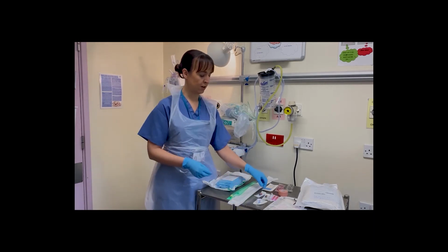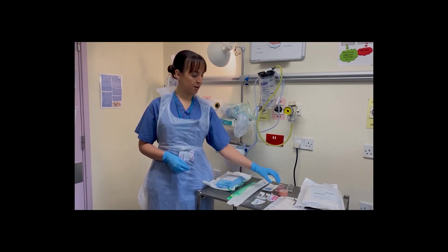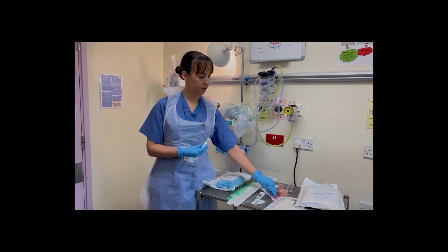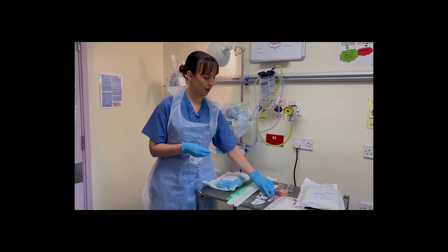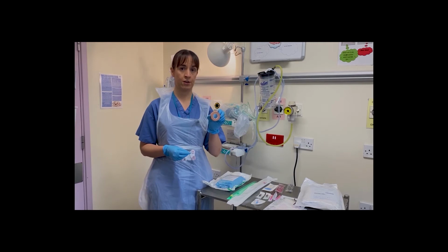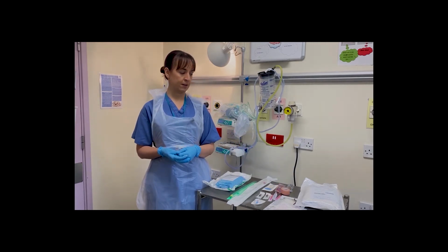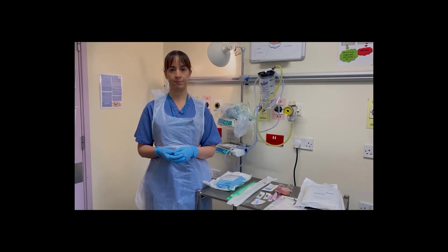You also need some bungs and some 3-way taps, some saline and some filtering needles to flush your lines, some elastoplast tape for securing your lines at the end, and obviously you'll need your sterile apron and sterile gloves.